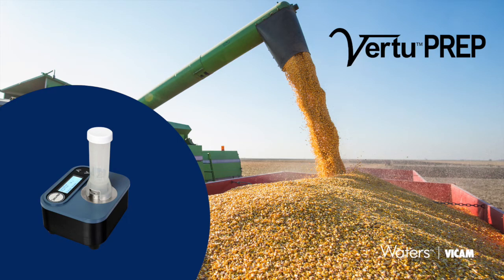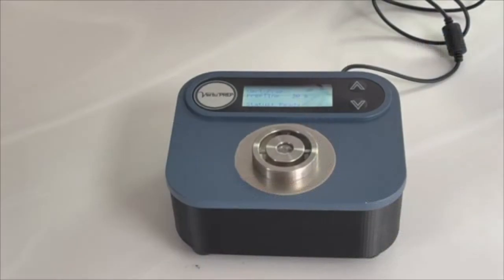The Virtu Prep Mixer is part of the single extraction series of lateral flow assays with precise numeric results from Vicam, and can be used in conjunction with the Vicam Virtu Touch and Vicam Virtu Readers.